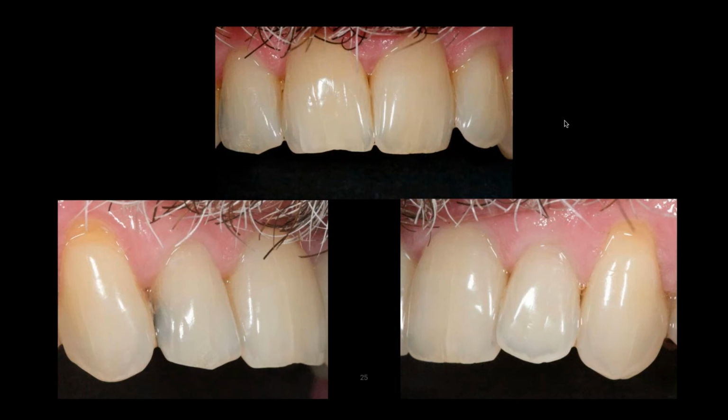So if you've ever seen finished zirconia crowns and you're patting yourself on the back, how close they look to the shade guide, when it's outside the mouth, you say, wow, this looks pretty darn good. And then once it goes into the mouth, they are automatically much brighter than the teeth. And that's because they reflect a lot more light.